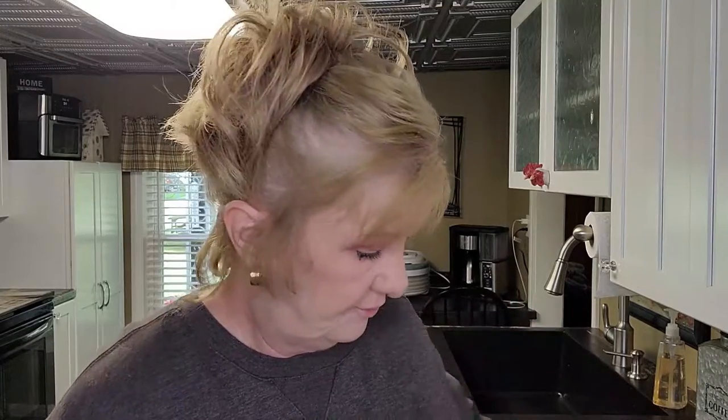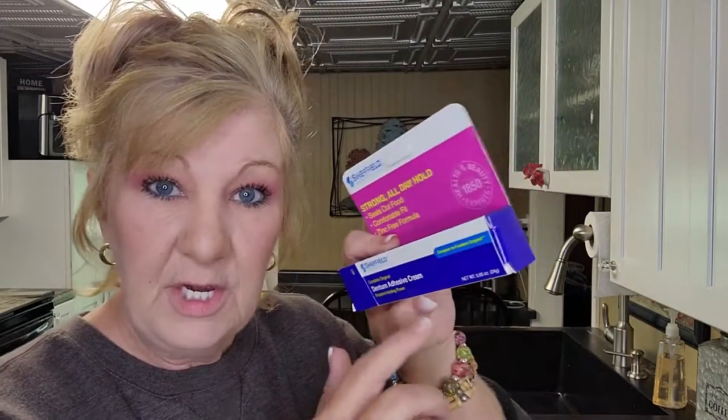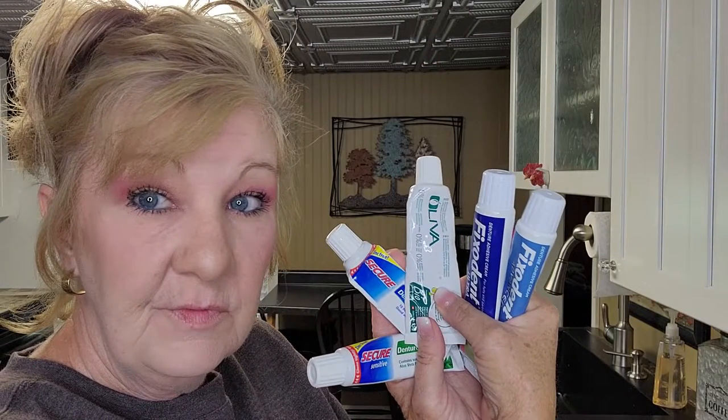I've gone through a ton of adhesives so far. First of all, get something you can afford — you've already spent mega dollars on your dentures. This one is from the Dollar Tree, and I just reviewed it compared to Fix-It original. I would recommend any of these. These two are the Secure — I really like these. This is Secure with aloe, and the Secure with Advanced, no aloe. I also have Fix-It and Ultra Fix-It Advanced.